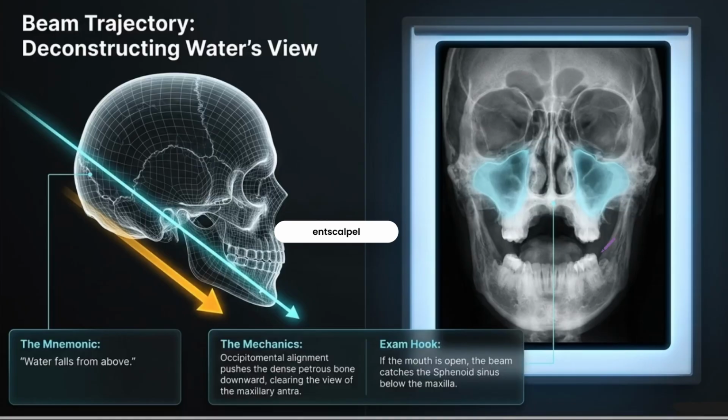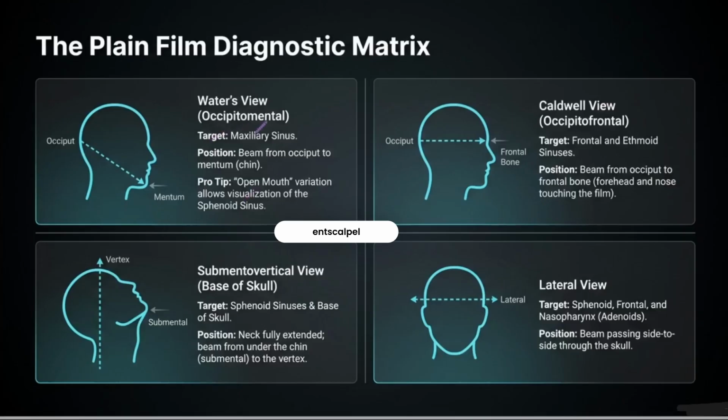It's non-negotiable. Utterly non-negotiable. You cannot identify a pathology like a carcinoma or a severe polyp without first intimately knowing the normal, healthy anatomical structures of that specific patient. And the lecture treats reading a CT scan like slicing a loaf of bread, which I found so helpful. It's a brilliant analogy. Right, like if you look at the outside of an unsliced loaf, you know it's bread, and you can safely assume there are air bubbles hidden inside somewhere. But you don't know exactly where they are.